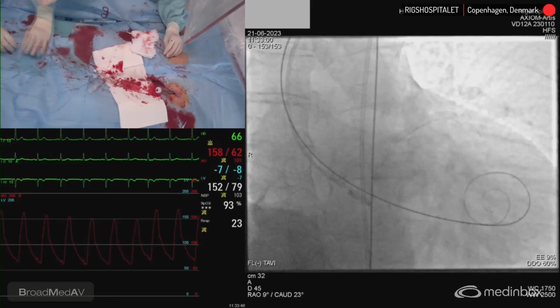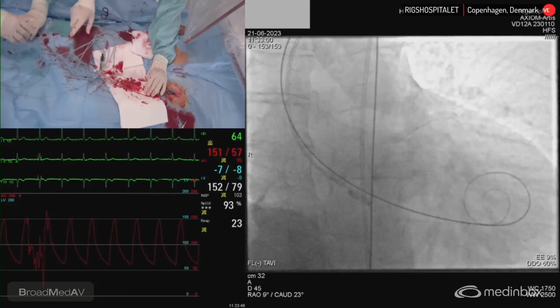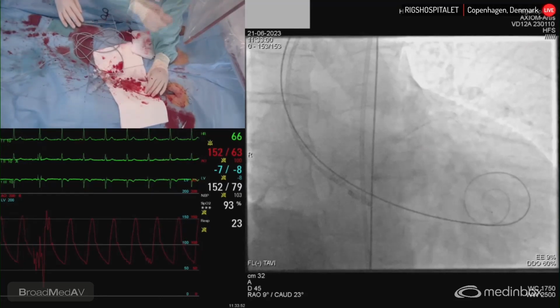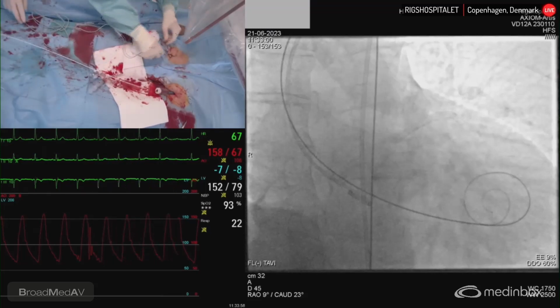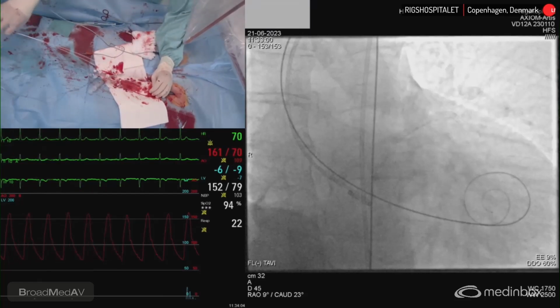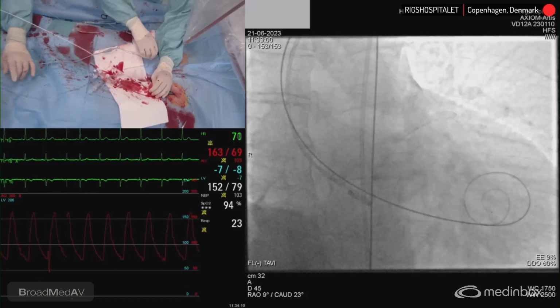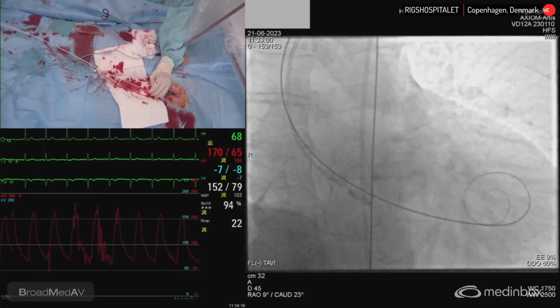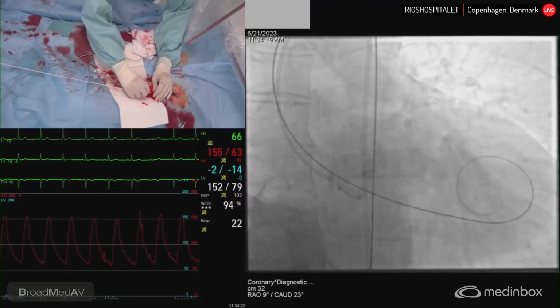Okay, that's good. Yeah, you can give it to me. So that's just the crocodile electrodes. Are you okay with it? Wait a second to go in with the balloon, please. Let's arrange everything first properly. Can we get this out of our operation field, like a bit further out? Otherwise we have such a mess here. Is it possible or not? Yeah, okay, it's fine. Okay, it's good. Hold it in the axis of the leg. All right, you can go up. Yeah. Okay, good. Fine.